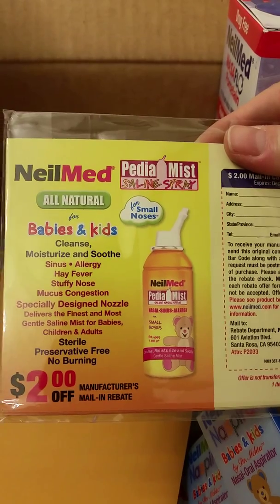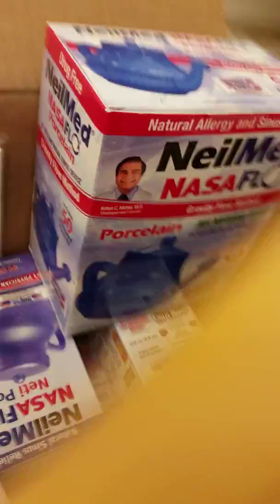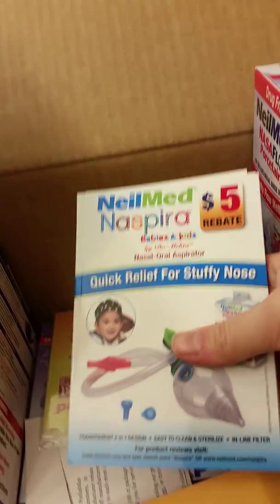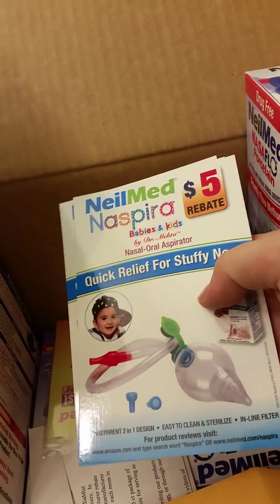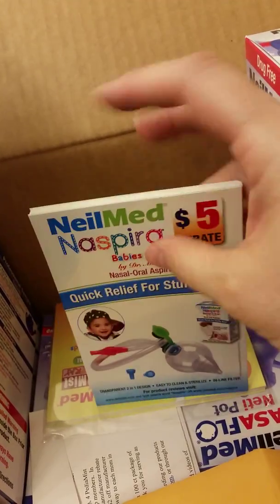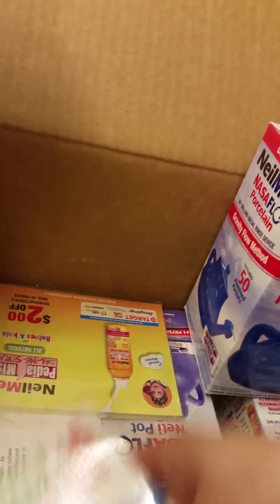There's also two dollar rebates for if any of my moms want to buy the Pediamist. There are also some more rebates in here for the basic nasal aspirator. I want to say these are 15 or 19 dollars at Target — we just saw them because I was showing my sister.